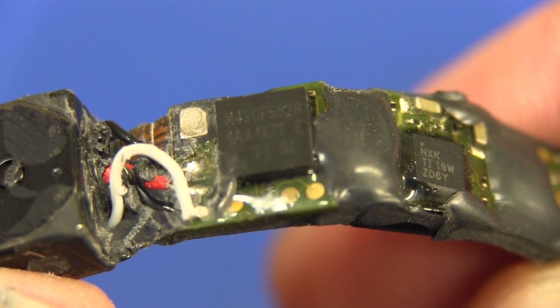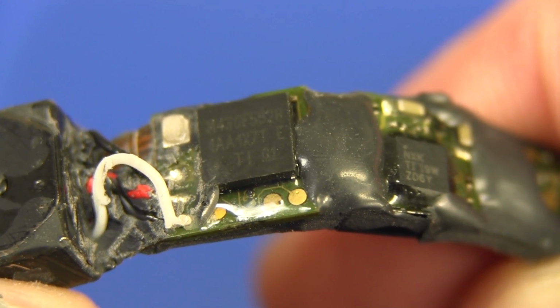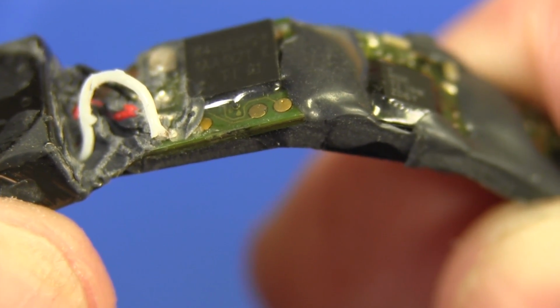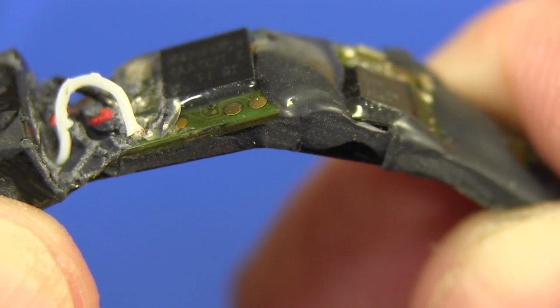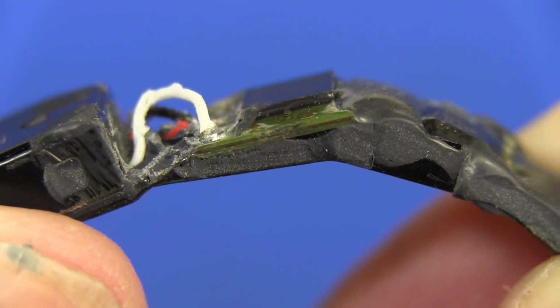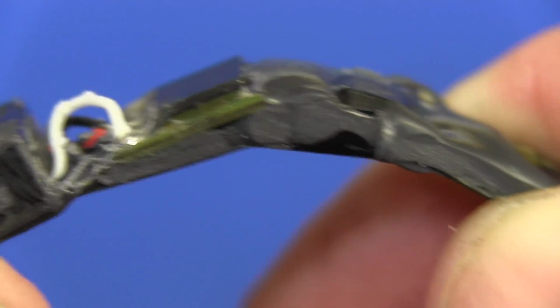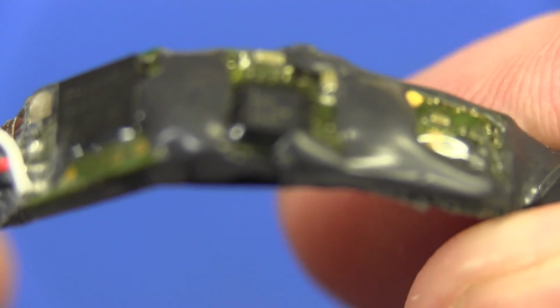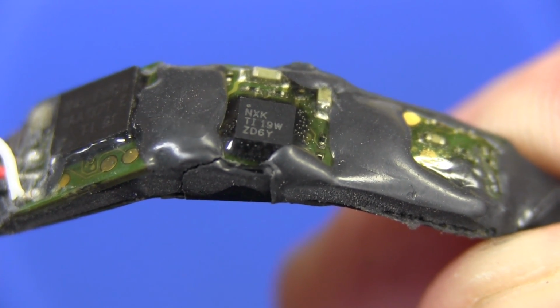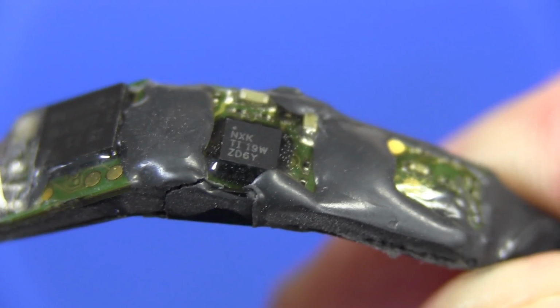And there you go, no surprises, a TI MSP430. This is the 430F5528 in a BGA package on what looks like probably a sandwiched flex board. You can see the PCB in there, you can even see the layers. I'll try and get a close-up view of the individual layers, but you can see the flex board sandwiched in the middle of that, which then goes off to the next board over here, which then contains, I don't know what that is, it's a TI 19W ZD6Y, bloody annoying numbers, you have to decipher those.